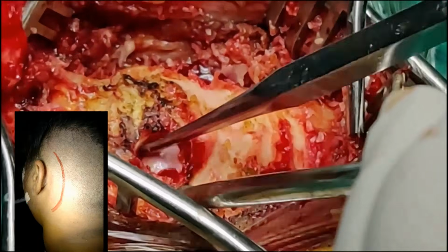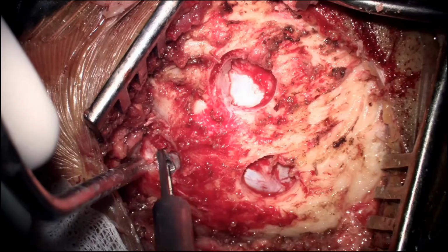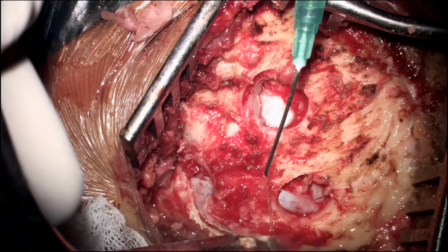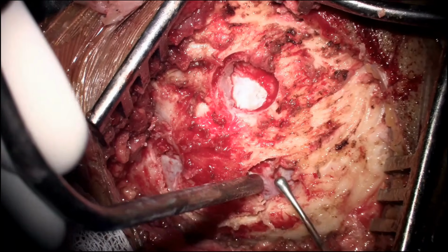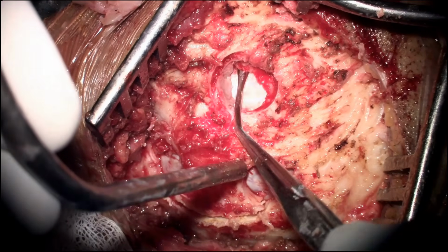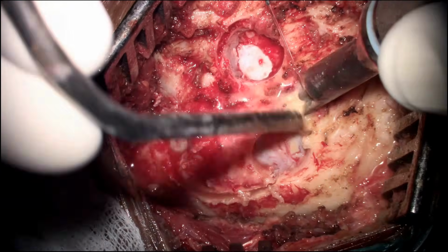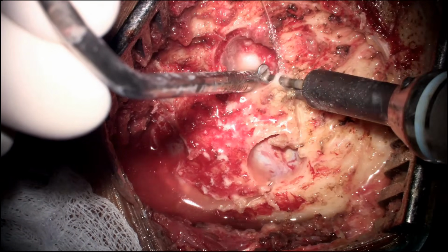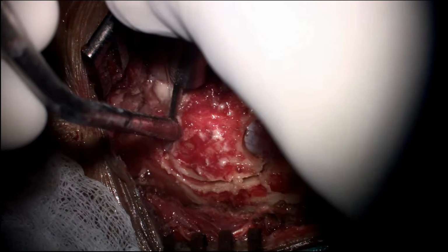These are the steps of retromastoid suboccipital craniotomy. We prefer to make 3 burr holes, 2 superiorly and 1 inferiorly up to the foramen magnum, and join the burr holes with the craniotomy cutter after separating the underlying dura from the bone as shown here. We prefer to do a little wider craniotomy in these cases as shown here. The burr holes are joined with the craniotomy cutter and the free bone is removed.